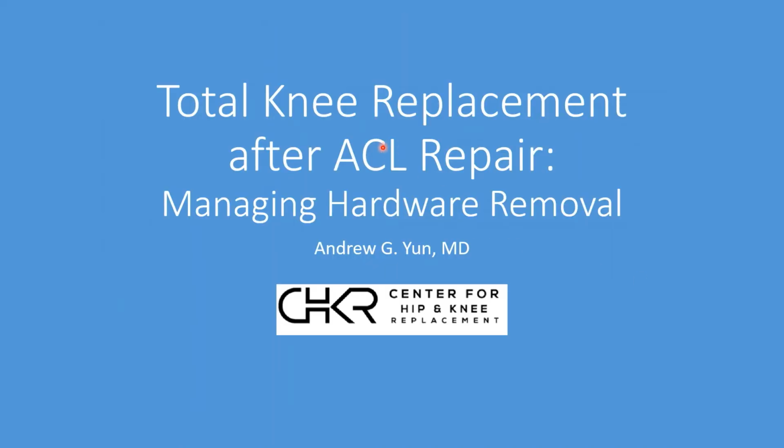Okay, so converting a knee after a prior ACL repair that's developed traumatic arthritis into a total knee replacement is a far more difficult procedure than routine knee replacement. And in this video, we were just talking about how we dealt with the hardware and specifically how we leverage technology, CT scanning and three-dimensional modeling, to help us understand what needs to be removed and what should be preserved.